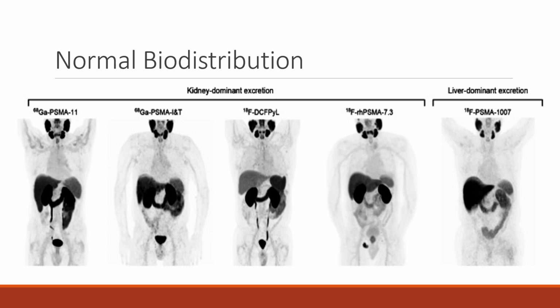Also, you really need them to void before they start. This is difficult sometimes with prostate cancer patients. Some of them can't empty their bladder all the way. Some of them don't feel like they have to go, or they have trouble starting their urinating. Some of them have some incontinence issues. So that can cause contamination on there. It can cause the bladder not to empty all the way, which makes it harder to see if there's lesions really close to the prostate. So all those things can kind of get in the way, but the images are really good.